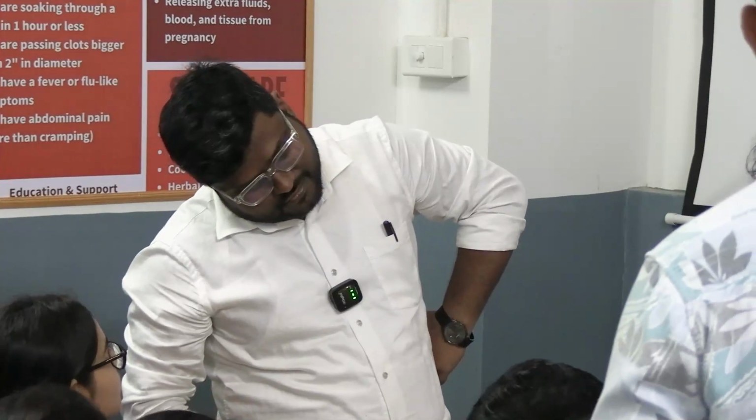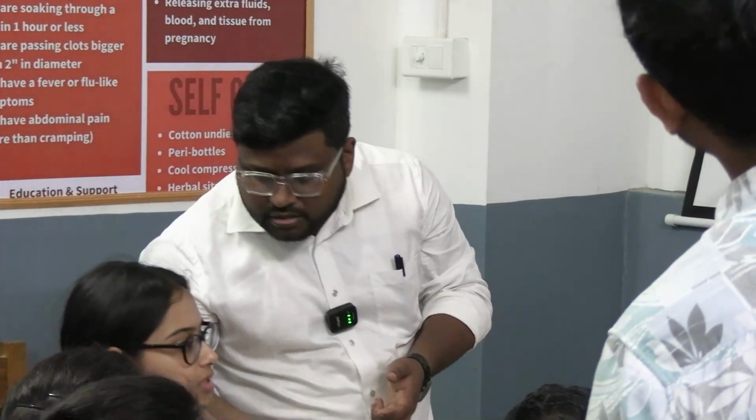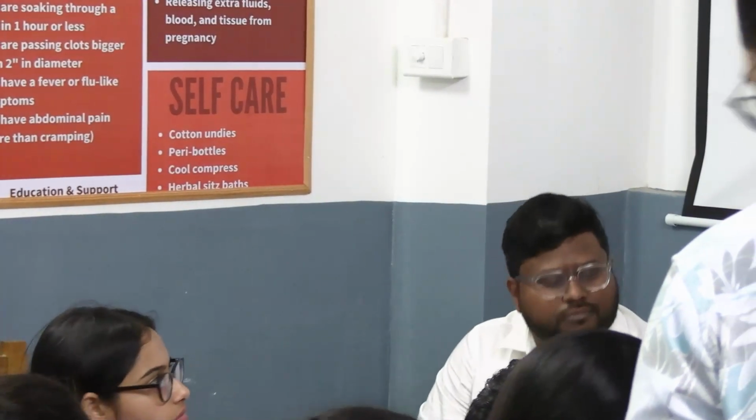অপারেশনে তিনটে জিনিস আমরা ধরতে পারবো না, তো এটা কি লেফট হ্যান্ডে স্পঞ্জ হোল্ডার, রাইট হ্যান্ডে ইনস্ট্রুমেন্ট। সেম স্পেকুলাম অন্য এক্সামিনার ধরে দেবে। না না তুমি খোলো, দেখে আসতে হবে। খুলতে হবে, রাইট হ্যান্ডে হাতটাকে উপরে দিয়ে খুলতে হবে। লেফট হ্যান্ডে স্পঞ্জ হোল্ডার ধরে আছি, রাইট হ্যান্ডে তো কিলিস ফসেপ দিয়ে কপারটি ছেড়ে চলে আসবি। এইটা প্র্যাকটিস করতে হবে। If you don't open the ratchet, it will come out with your hand. Your purpose is to distribute inside the uterus.